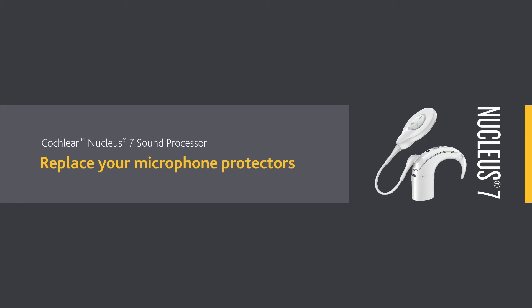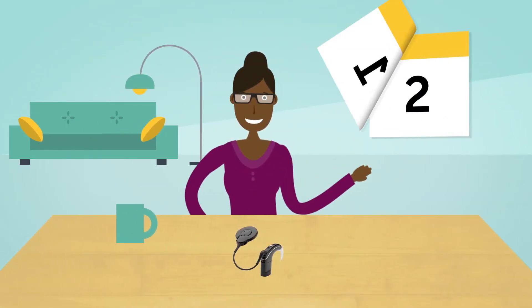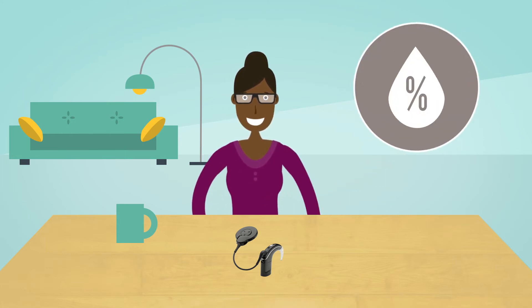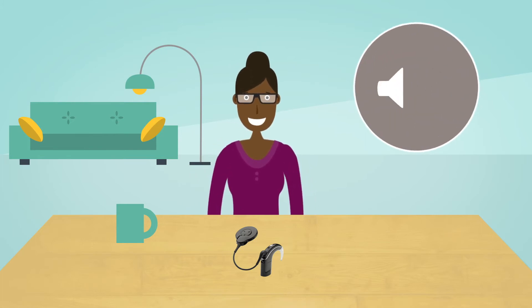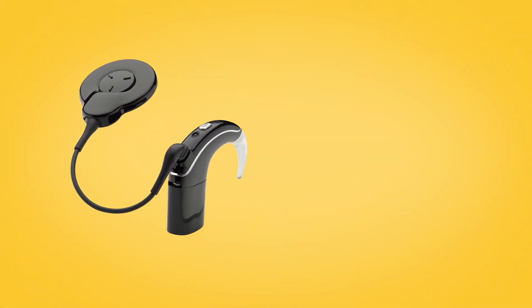You should replace your Cochlear Nucleus 7 sound processor's microphone protectors every three months, or sooner if you live in a high humidity environment, perspire frequently, or notice degradation in sound quality. It is important that you keep your microphone protectors in place at all times.